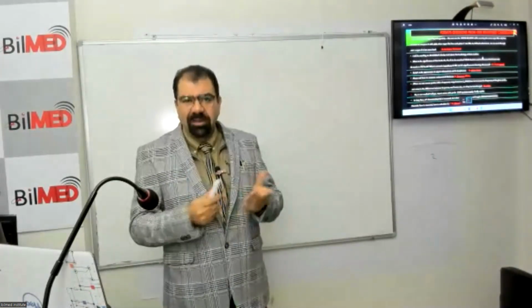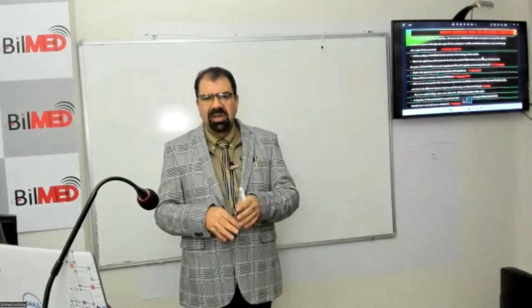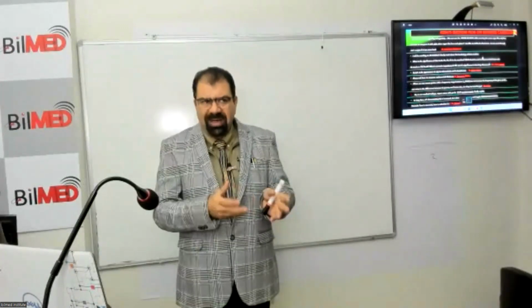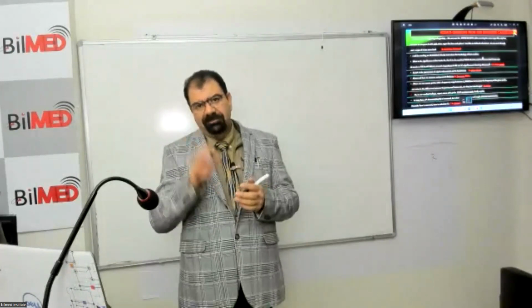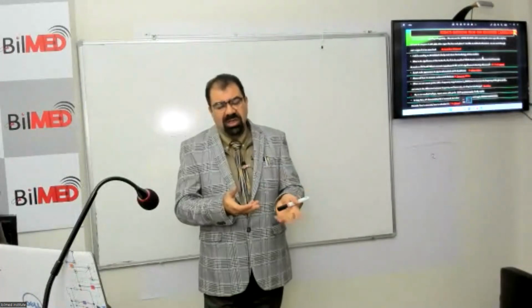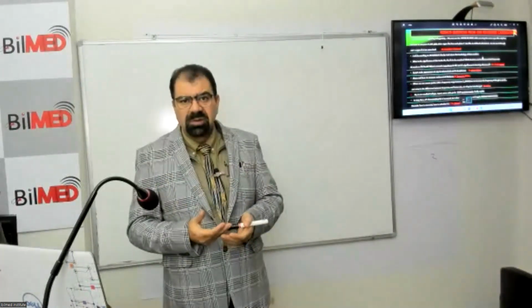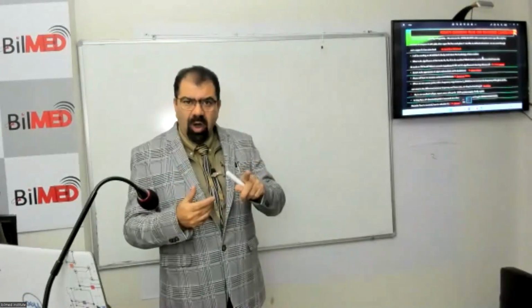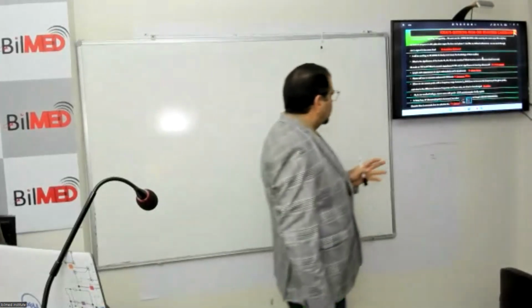In some machines, P3 is for print. But I cannot say that P3 is set to print. In Logiq, probably, I'm recalling from my memory, P3 is for print. But maybe in a P5 machine, in the same Logiq machine, it is not for print but for save. You have to see for yourself. I cannot say that this knob will be forever for this.